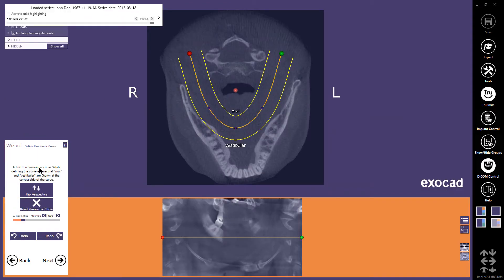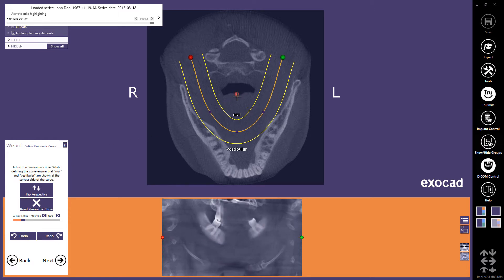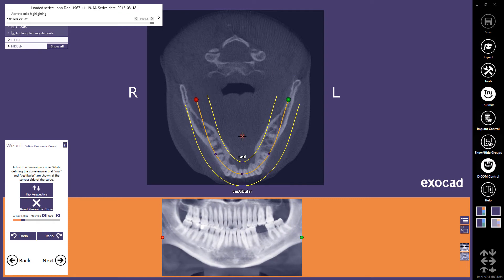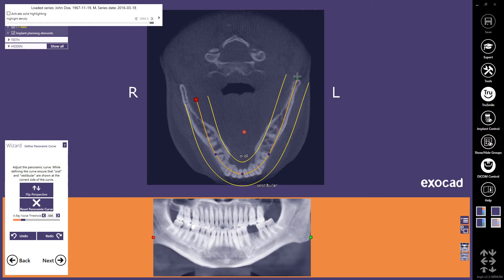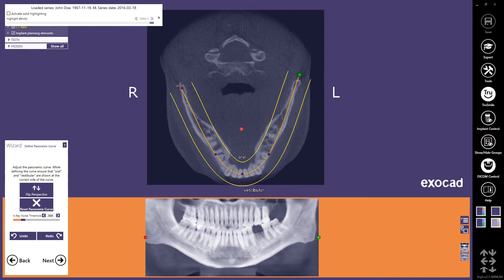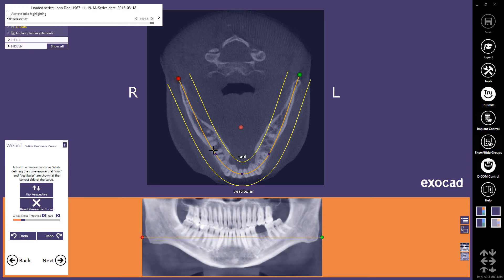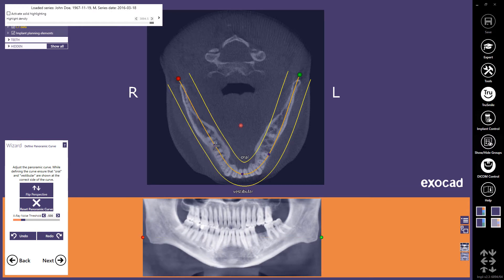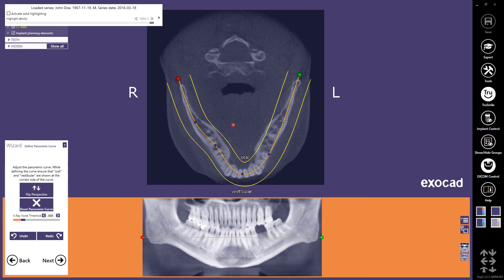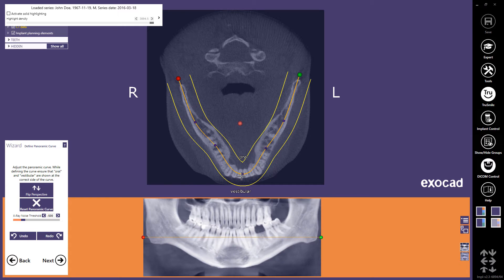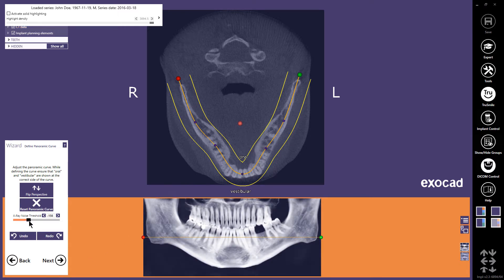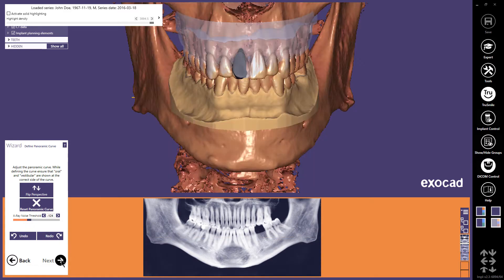In the Panoramic curve definition step, use the control points to define the panoramic curve. You can move the whole curve with the red control point in the center. Change the curve by moving control points and add points by clicking on the orange curve with the left mouse button. In the wizard window, you can change the x-ray noise threshold. Continue with Next.